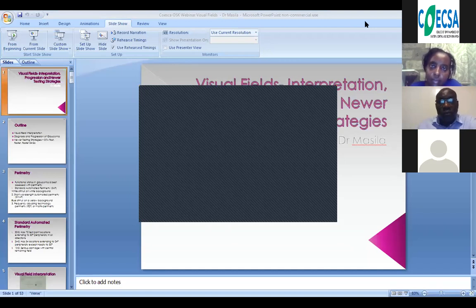So it's a matter of looking at what the Kenyan one recommends. I'm sure they also have specifications for the spot size and the intensity of the light for the field. So it's just a matter of looking at the small print and conforming to that.